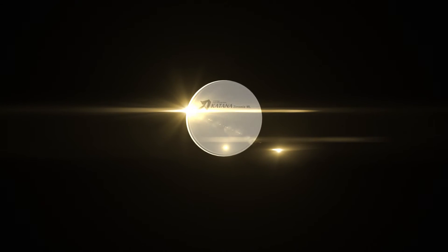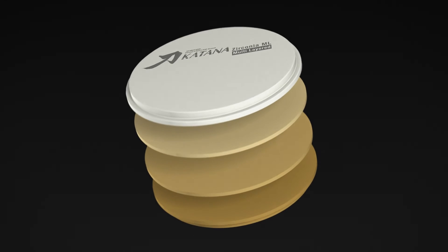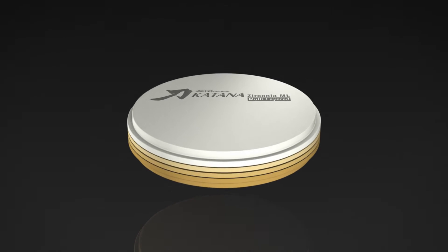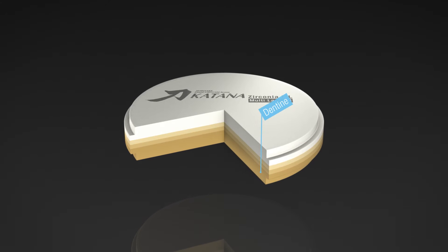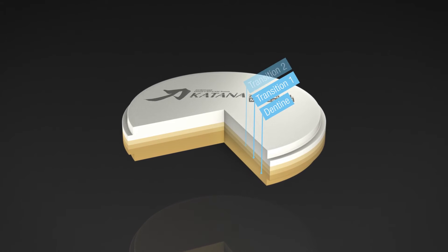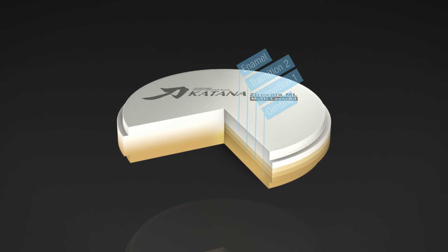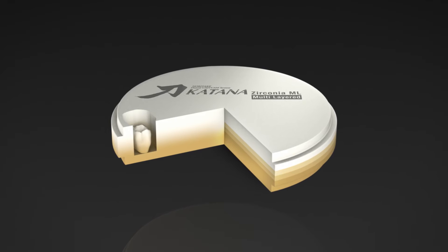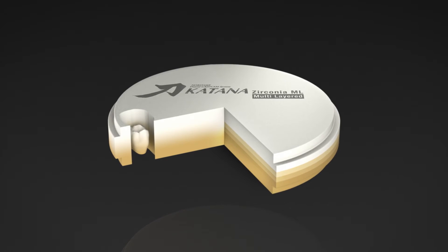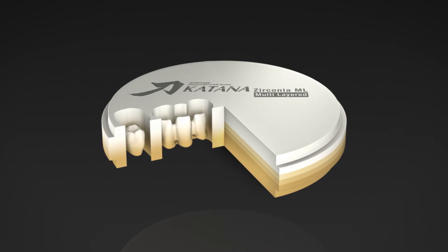Katana Zirconia ML — the first multi-layered zirconia blanks with a color gradient. Katana Zirconia ML discs are produced with a color gradient from the neck of the tooth to the occlusal surface, as it is the case in natural teeth. In that way, fully colored crowns, bridges, or polychromatic frameworks that correspond to the natural color gradient of a tooth already emerge during milling.